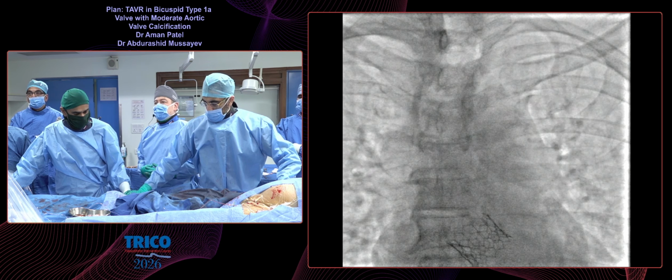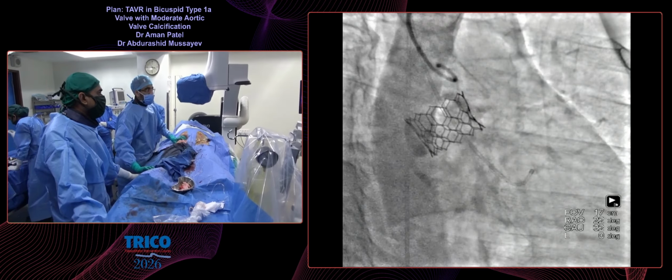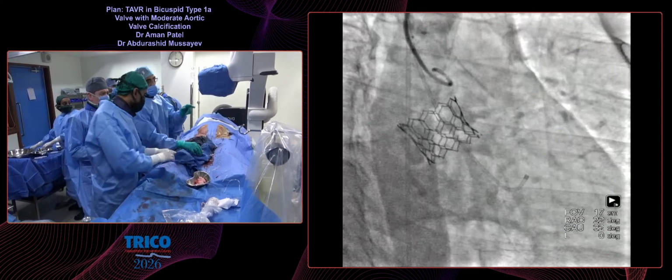But just to say again, this is just a fantastic result. Amazing technology, amazing professionalism, expertise. Did we get an echo? Yes, we are now starting the echo. Please show the echo on the main screen.